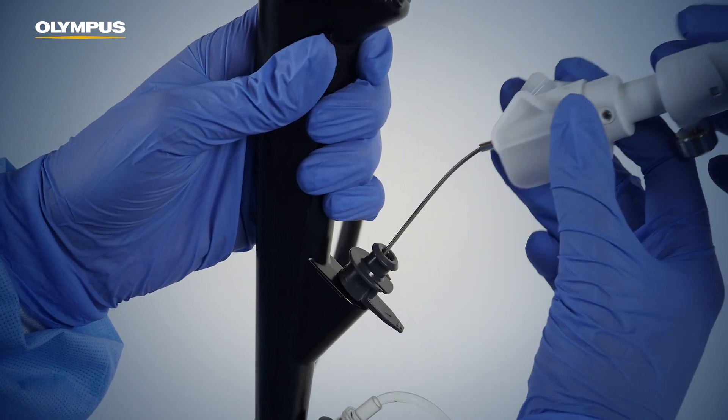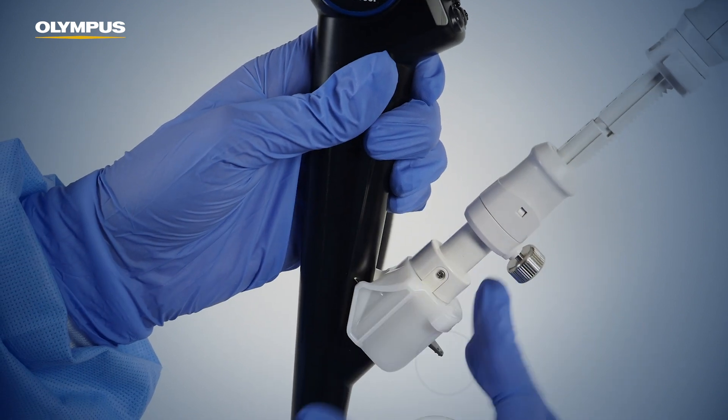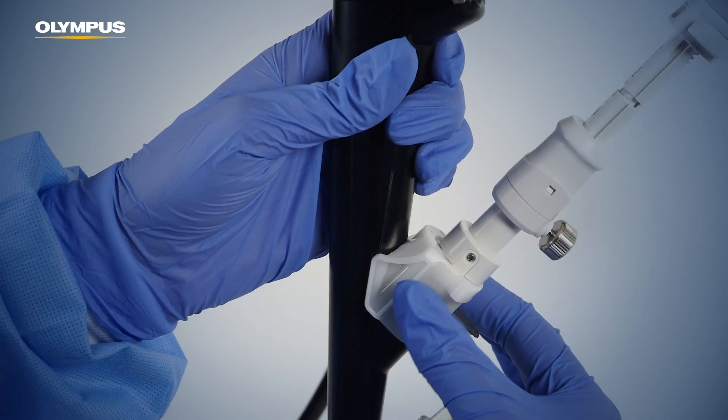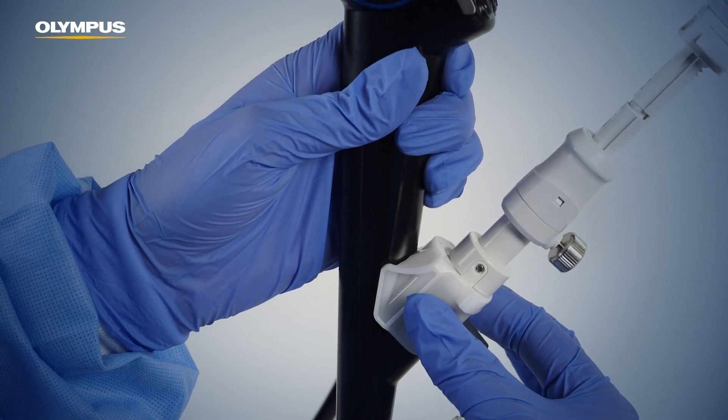Confirm that the connector sits firmly on the adapter biopsy valve. Make sure that the pull tab of the single-use adapter biopsy valve fits in the slit of the connecting slider. Otherwise, the handle may not be properly connected and disconnected. Connect the needle system to the endoscope by pushing the connecting slider of the needle over the sleeve of the adapter biopsy valve, and confirm that the handle section is firmly secured to the endoscope.